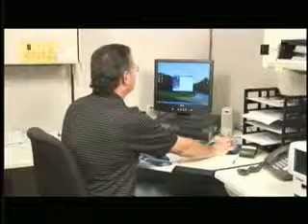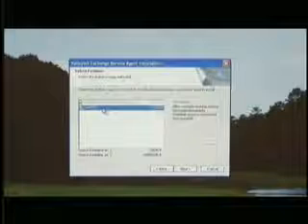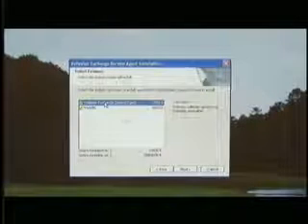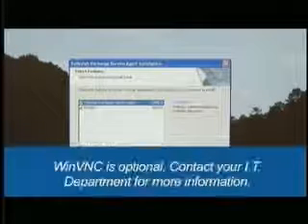Once the CD is inserted into the service PC, it will auto-run and present screens to aid with the installation process. This screen shows the Force Triad agent software as well as an option to select the WinVNC component to be downloaded to the PC. Loading the WinVNC application will allow remote desktop assistance from a Valleylab support team member.